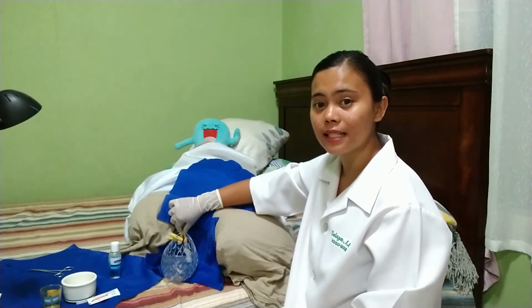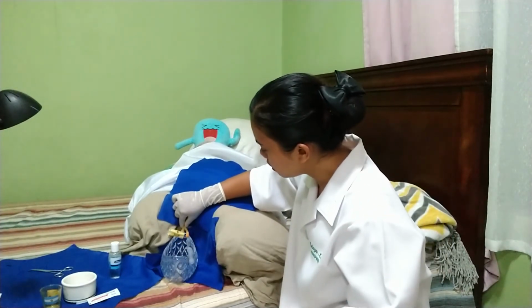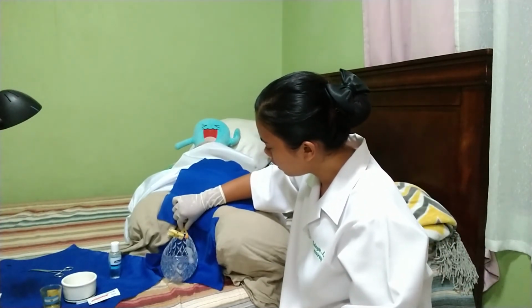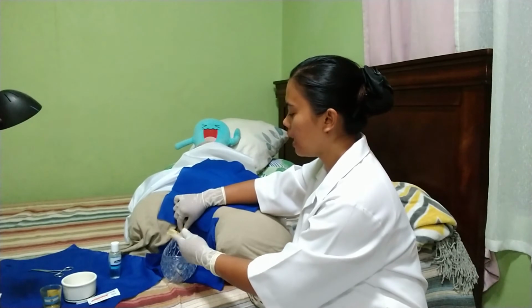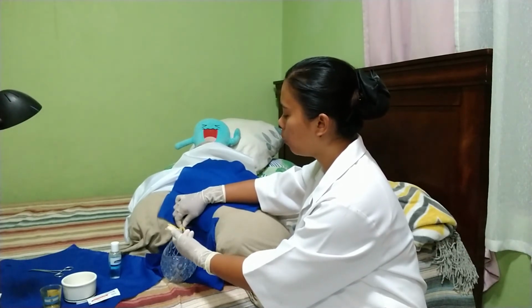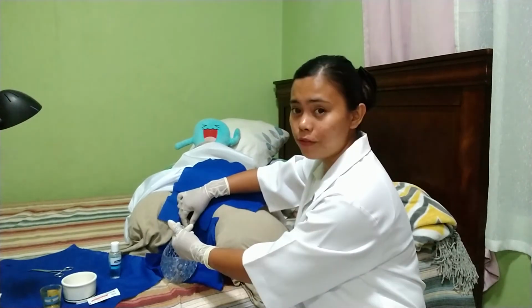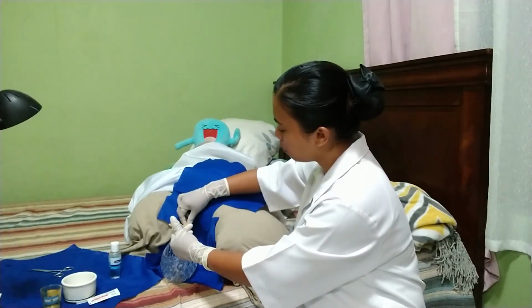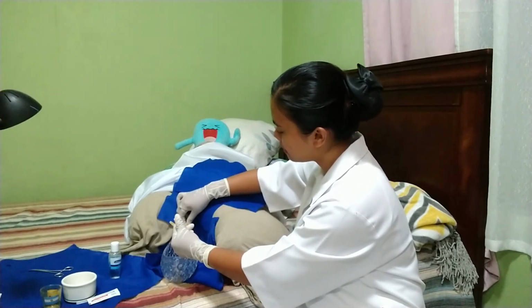After covering and setting aside the specimen container for urine, advance the tube for at least 2 centimeters more to make sure that we are not in the neck of the bladder. Next thing to do is to hold the syringe and inflate the balloon with 5 ml sterile solution. Inflating the balloon is important to make sure that the catheter will be held in place inside the bladder and will not slip out.